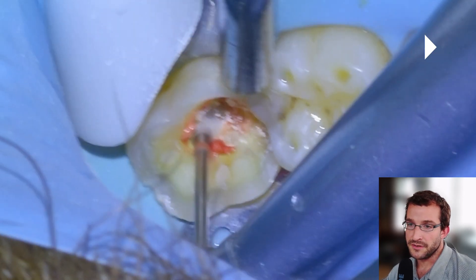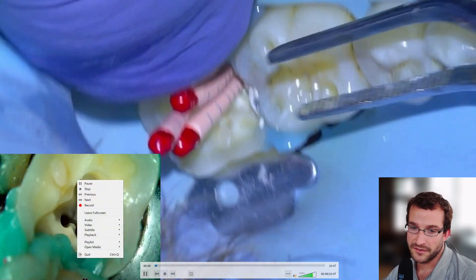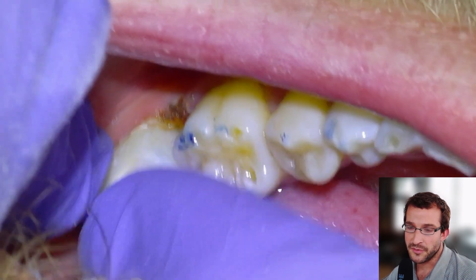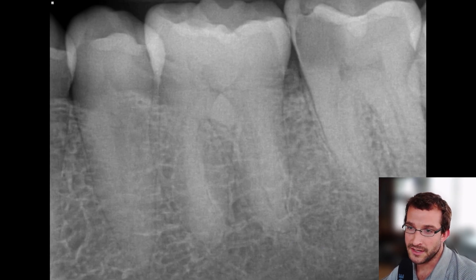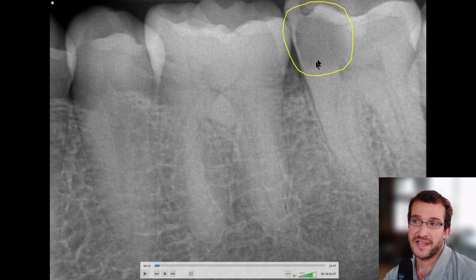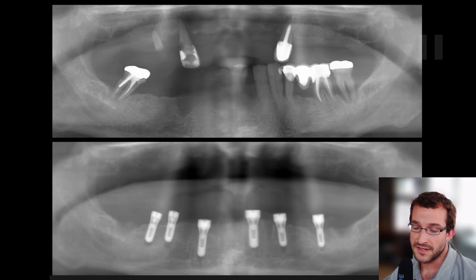Hey guys, Dr. Dobson. We're going to be doing a 3-7 endo and crown prep in this video. Here's the final preparation, and here's some trailer footage — we did the crown prep right after the endo. The patient presents for a spec exam in severe pain, big cavity into the nerve. Can't do a filling with selective caries removal at this point; needs an endo and a crown. So that's what we did — we actually did it on-site, canceled some appointments, and got him out of pain.